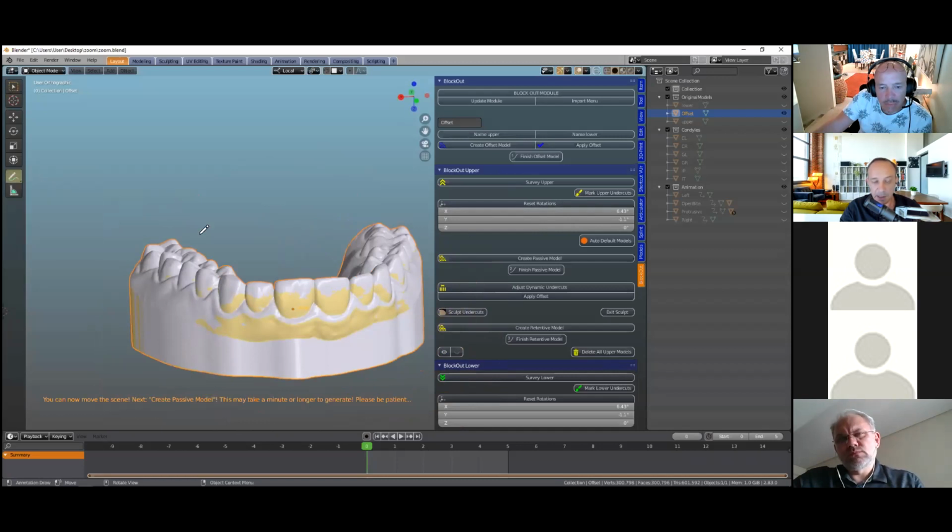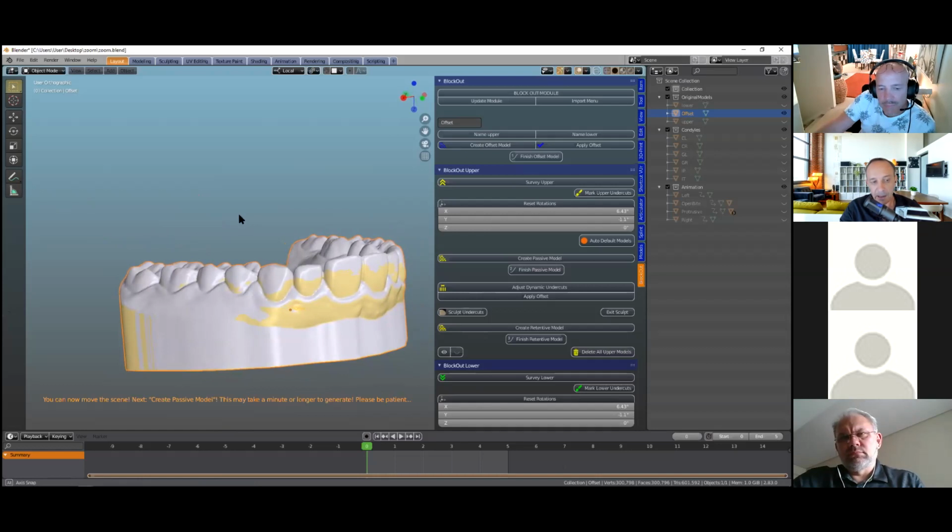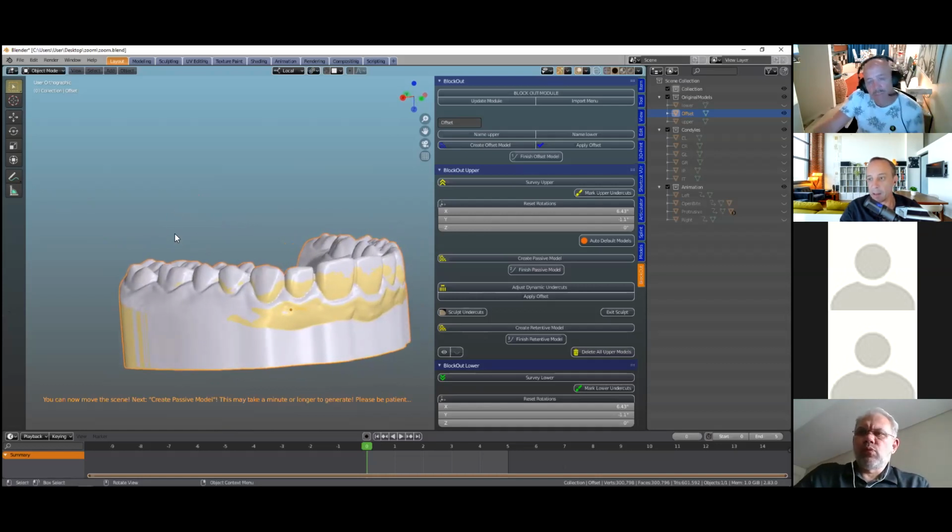We need to sometimes incorporate little wire interproximally that can, like an Adam's crib when we make orthodontic removable appliances, then we would carve away a little bit of the gingiva and try and find an undercut, because you can't create undercuts. You can survey for undercuts, but we can't make undercuts, but we can look for them by going under into the interproximal area.